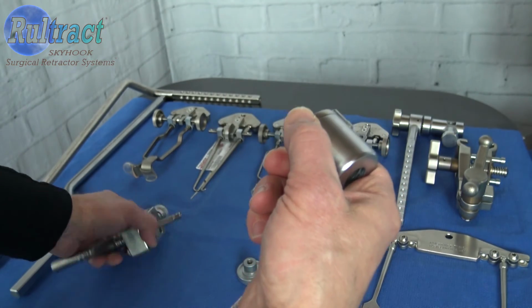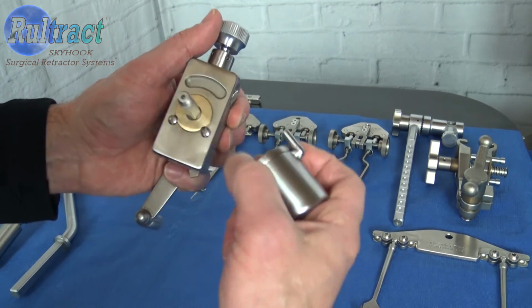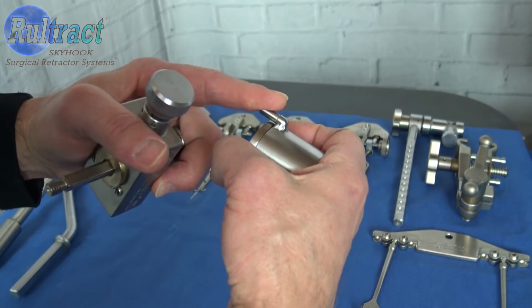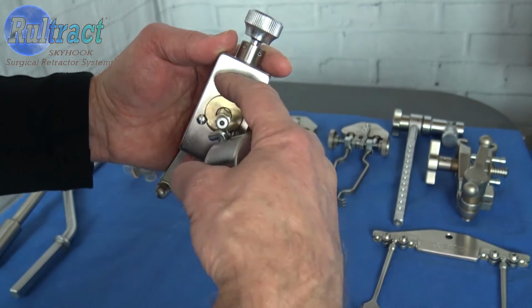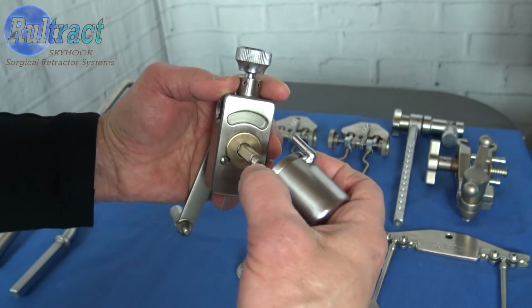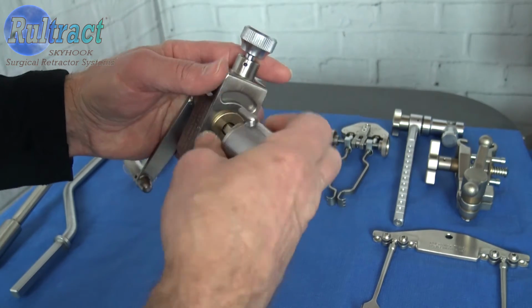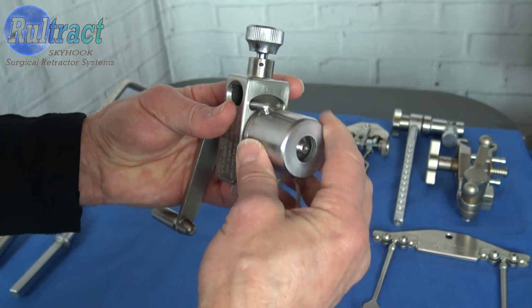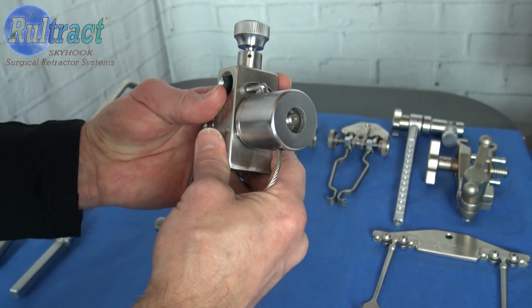Next, we're going to put the spool cap assembly onto the gearbox and crank handle. Now you'll see there's a groove cut into the gearbox. There's a pin on the spool cap. We want to make sure that that pin is inserted into the groove. That's very important. So go ahead and manipulate your spool cap assembly onto your crank handle and insert that pin into the groove.